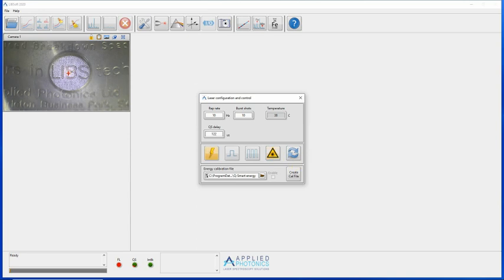Under manual control, the laser repetition rate and energy can be adjusted as required. So if we change the repetition rate to 2 Hz, or we can change the energy to a low energy.